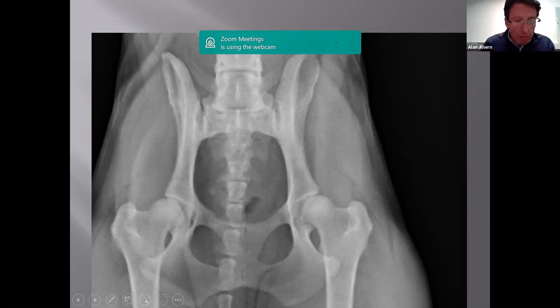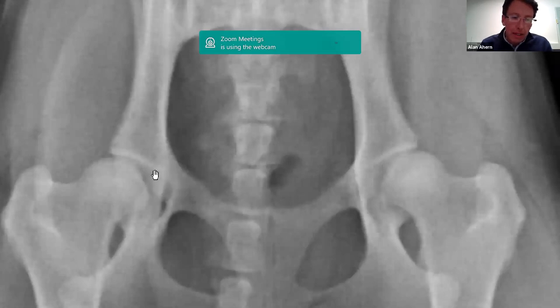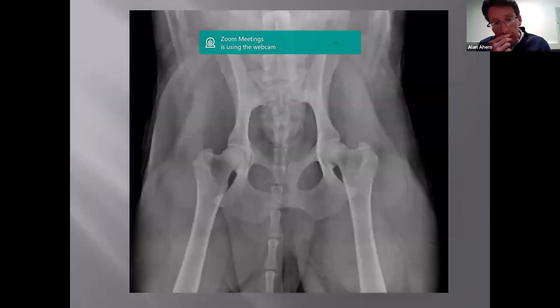If I blow this up a little bit, we can see that there is a little bit of looseness here. If you're looking at your x-rays, this is what you're looking at. Is there a bit of a space here? Is there straightening of this line? Is this line beginning to get a bit straight and flat looking? Maybe, possibly here. The other thing is that we have the ability in the clinic to measure what's known as the Norberg angles. That gives us another indication as to how loose these hips were. So these were a 9 and a 7, which gave us an overall score of 16. You could say the positioning isn't 100% here. It was very difficult to get brilliant positioning on this dog.